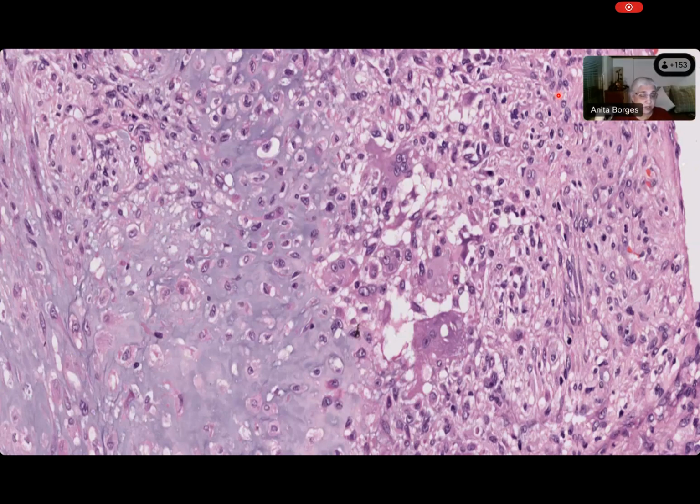Why do we say it's not the articular cartilage? Ma'am, because of the color, it is not that dark blue. Because of the color. Now come on, Prayas. Ma'am, because the mineralization takes place. Because of mineralization. Come on now. Hema, why is this not articular cartilage? The color is not hyaline cartilage.